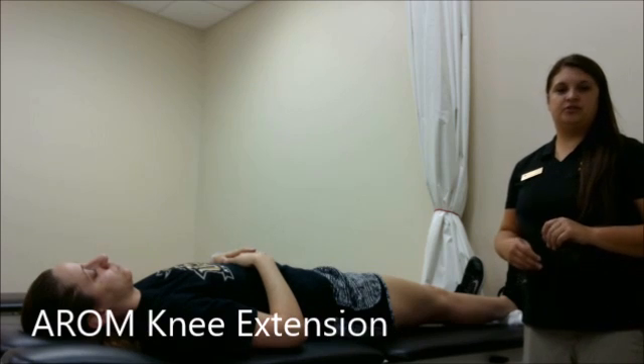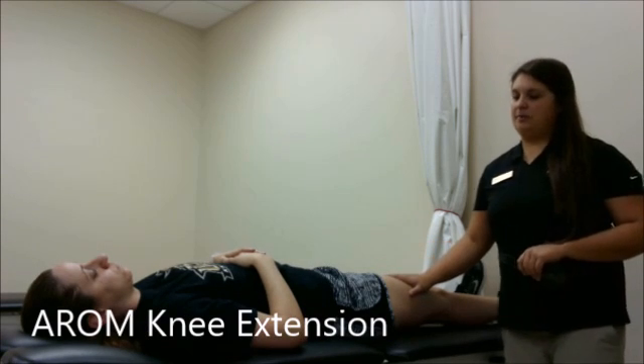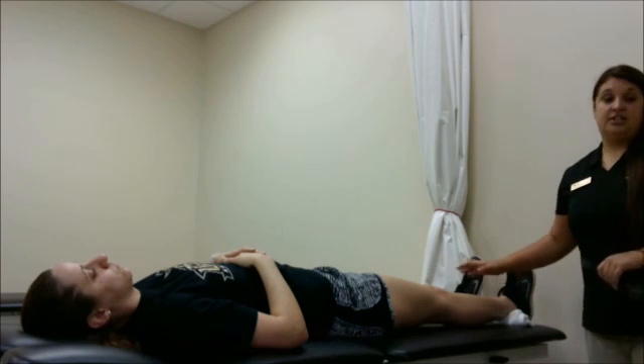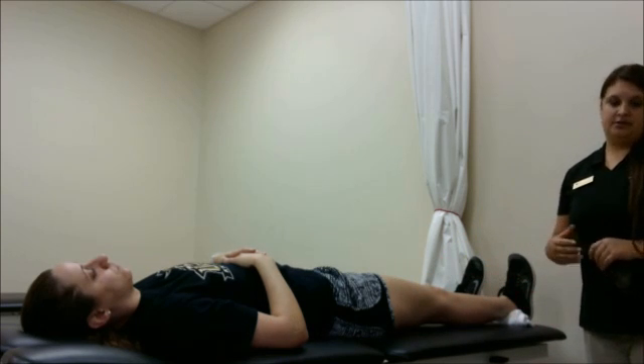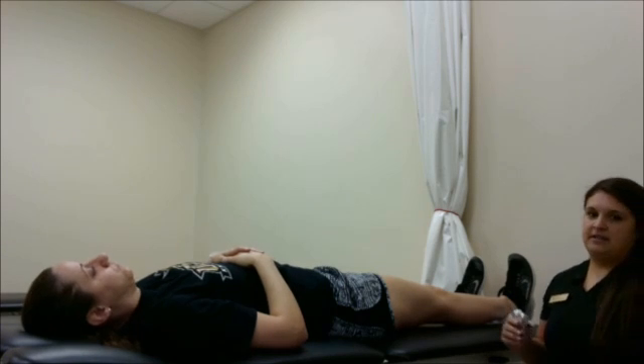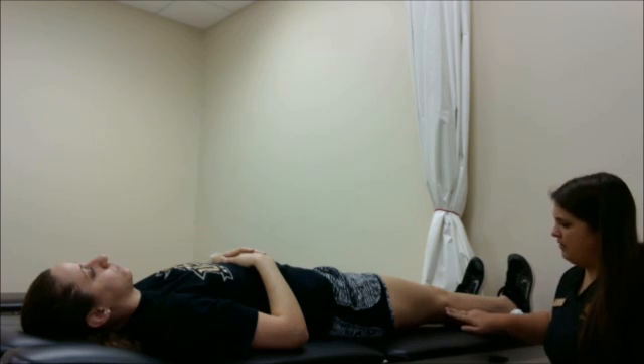Now we're going to be measuring active range of motion for knee extension. Again, my patient is in the supine position on her back. We have a bolster rolled up underneath her ankle, just in case she has any hyperextension, so we'll be able to measure that. I'm going to place the goniometer again at the same landmarks as for knee flexion, at the lateral condyle of the femur.